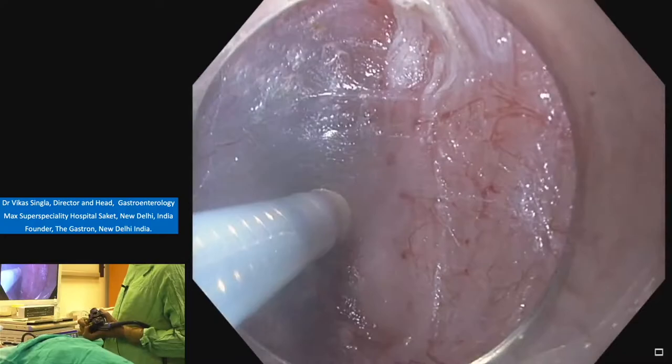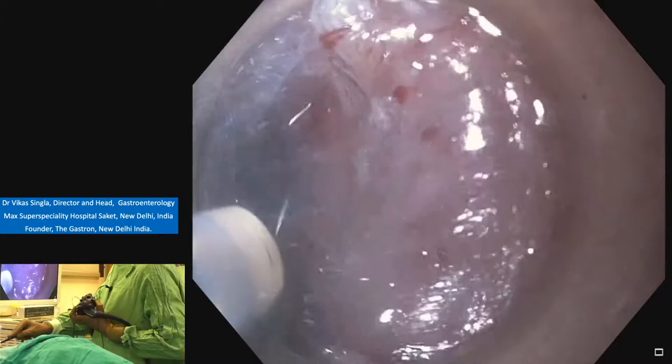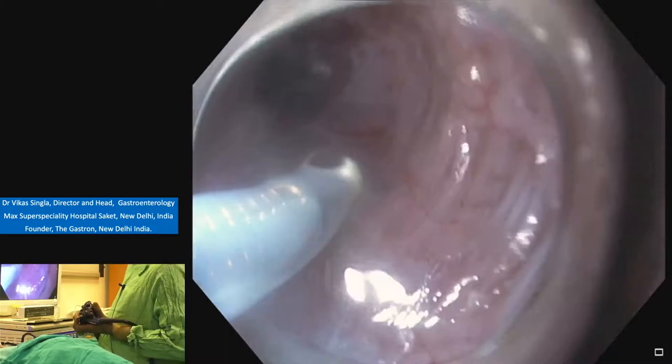And we should be more towards the lesser curve. For that, we have to go more towards the right side. If you are on the right, more on the lesser curve side, you can avoid the reflux. Inject. Now you can see both the layers are very close. So some vessel there. You will dissect here.